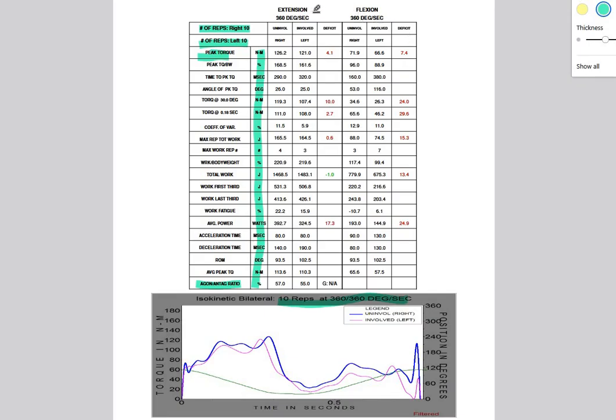So again, just to point out that we cannot isolate with isokinetic dynamometry alone individual muscles within a muscle group. We need to incorporate surface EMG for this, which we will talk about at another point. But it's certainly something that you can raise, albeit briefly, in your summative assessment.